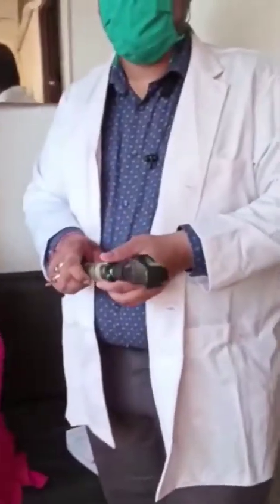Next we'll do retinoscopy to check whether any power correction or change is needed. We'll check the retinoscopy power and finish, if any correction is there.